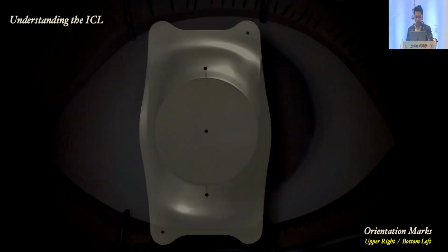And I'll just give you a little bit about ICLs. The disclaimer is that 99.1%, whatever percentage you can think about, do go well. So whatever we're discussing here is a very, very small fraction, but it's something that we all should know about in our daily practice if we are going to get into phakic ICLs at any point of time.